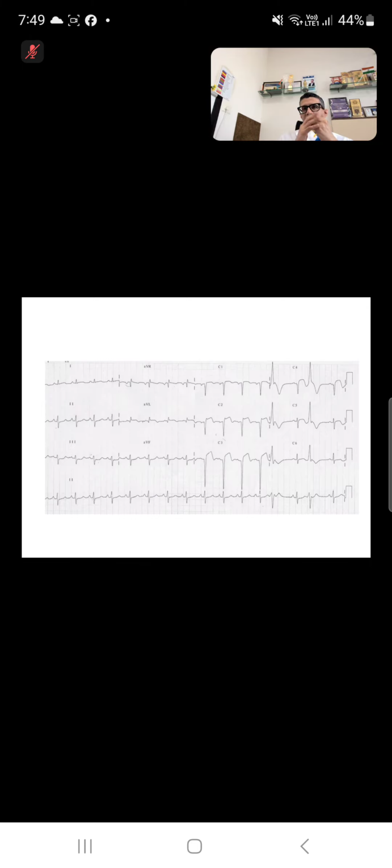A lot of fallacies can occur just based on the ECG. Something which is acute, you might mistake for evolved. Something which is evolved, you might mistake for acute. Multiple mistakes can occur when you try to diagnose just the timing based on ECG. So you should not fall into the trap.